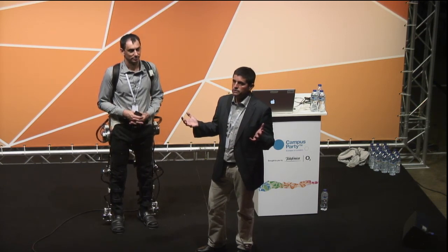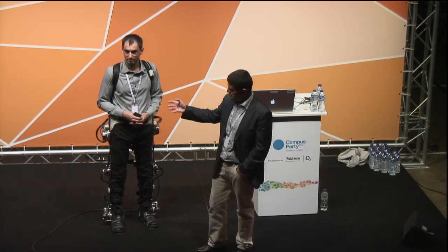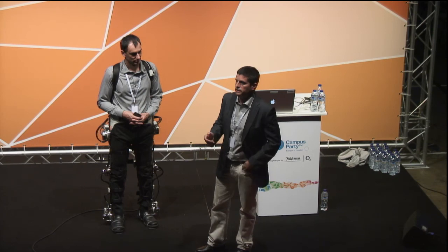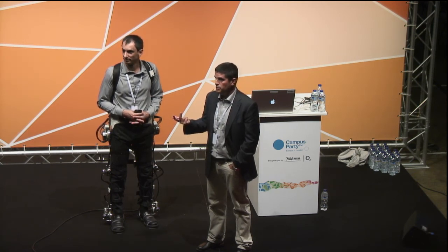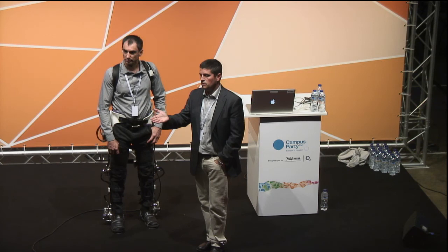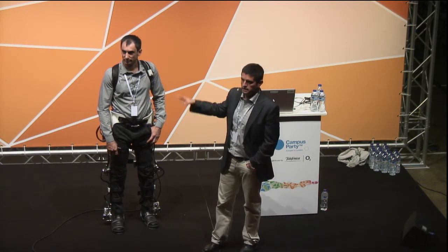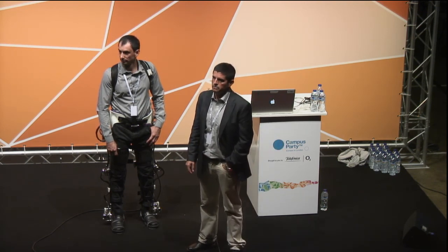Of course, everything related to mechanics, mechanical engineering for building the system, integrating the structure together with the actuators, electronics, and so forth, is also a big part of the project. Everything related to theories for rehabilitation, physical rehabilitation, is very important because this will help us to select which are the control strategies that we will implement in the control structure of the system. So there are many disciplines and fields that are involved in a project like this.